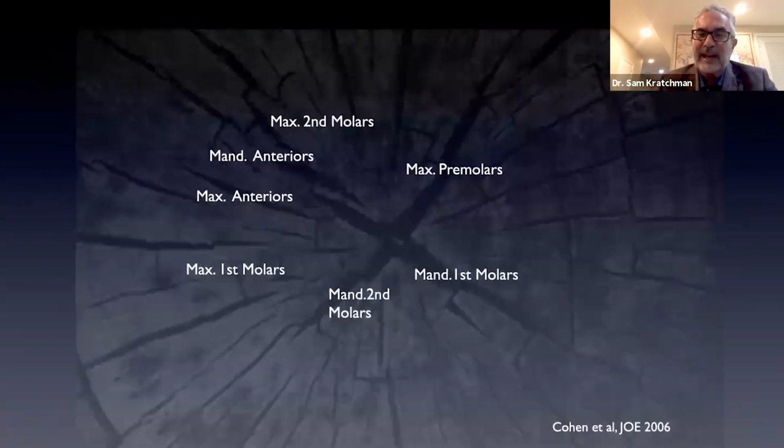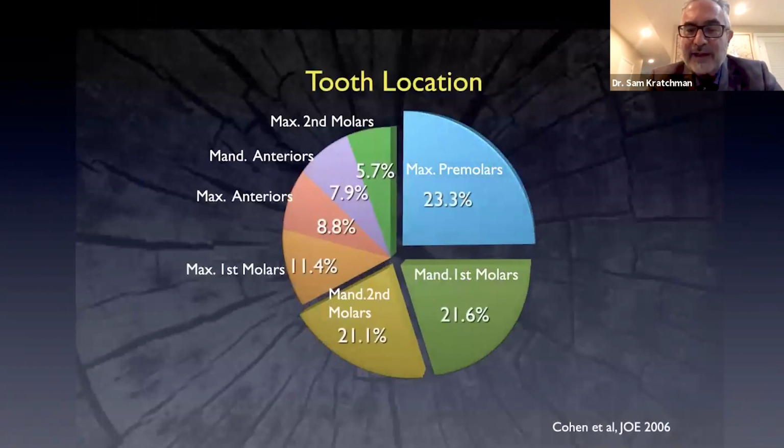But let's talk about the next topic, which is cracks or fractures. And as I say, as an endodontist, I see this every single day of practice where patients come in with these symptoms where it's a shallow restoration. They're all stressed, especially in COVID times.